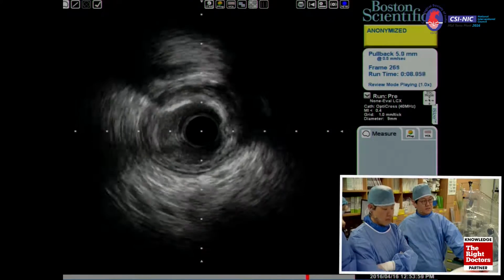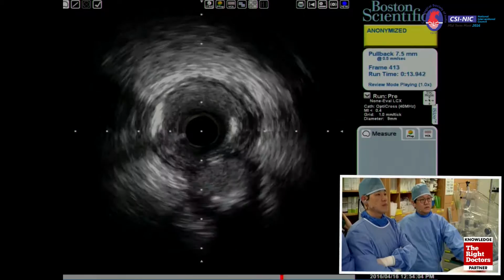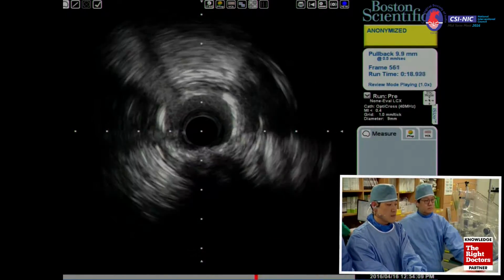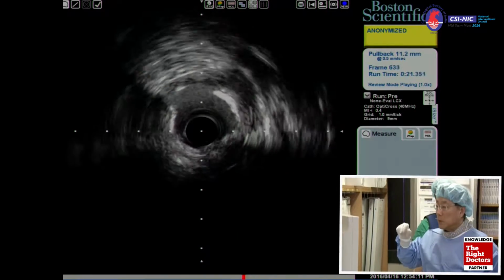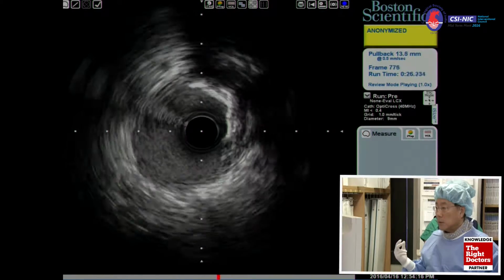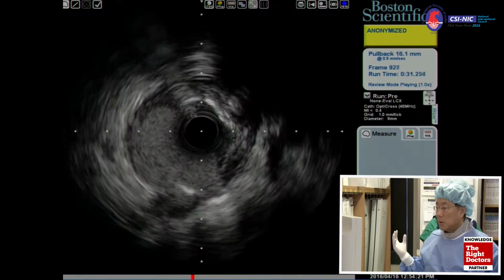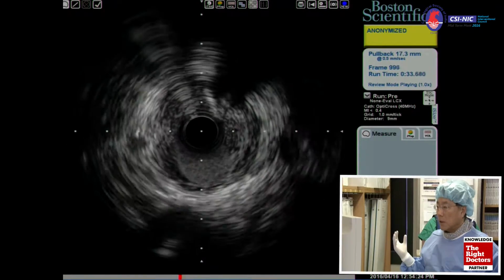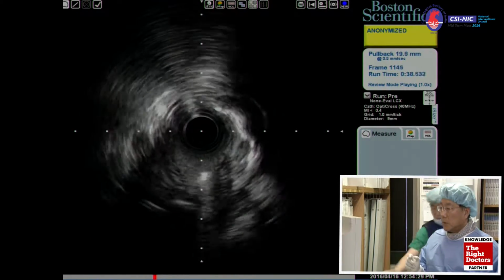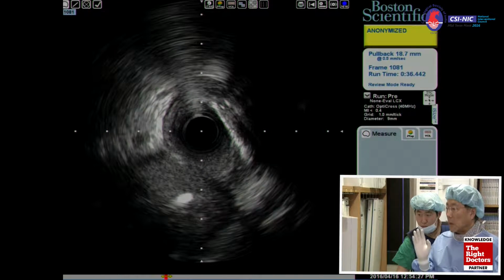Minimal plaque has some superficial calcium, and small branches from 5 o'clock. Superficial calcium still. However, the vessel is 3.0 or more than that as a big vessel. An eccentric plaque, smaller one, getting bigger vessel. Okay, small branches at 6 o'clock. Lots of plaque. All right, stop it. Okay, that is just 1 or 2 frames backward. Okay, perfect, that one.